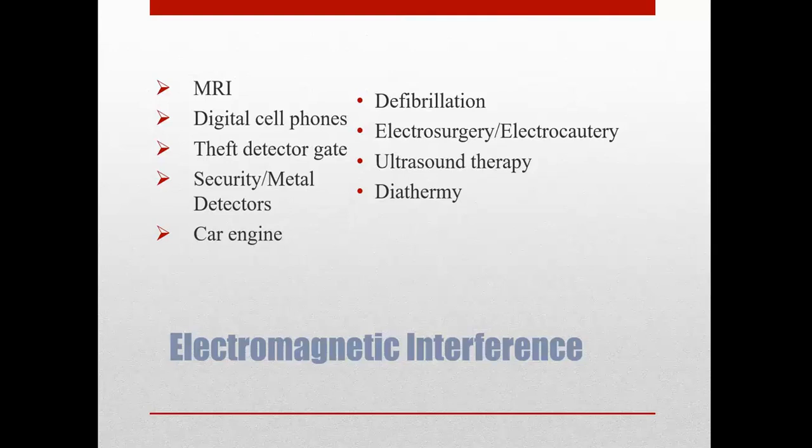According to the AHA, modern cell phones don't cause complications with pacemakers, but older phones and newer technologies can present some risk. So it's recommended that cell phones and iPads be kept at least 6 inches away from the pacemaker site. It is safe to pass through metal detectors and gate detectors, but patients shouldn't linger. Security metal detectors like those in airports can be passed through at normal rates, and handheld detectors should be avoided.